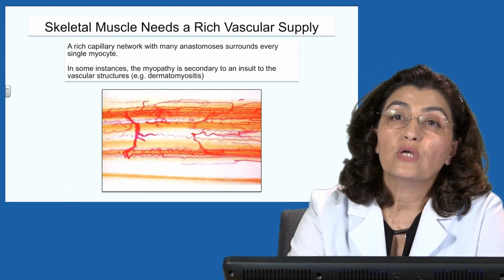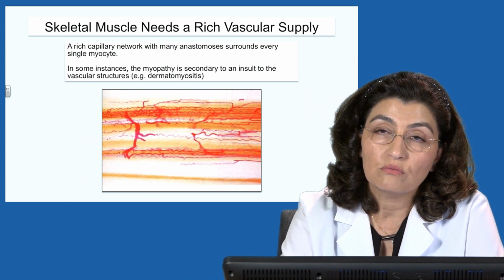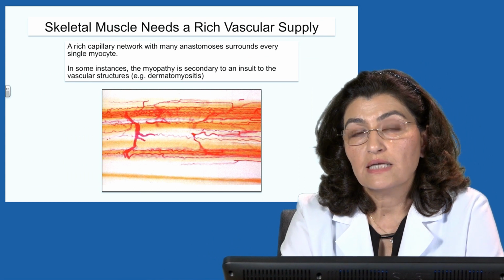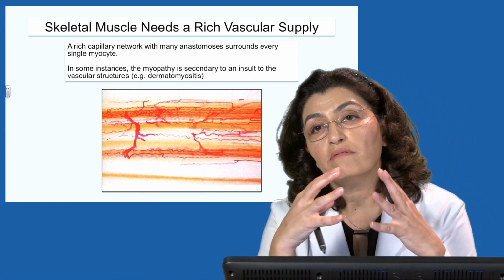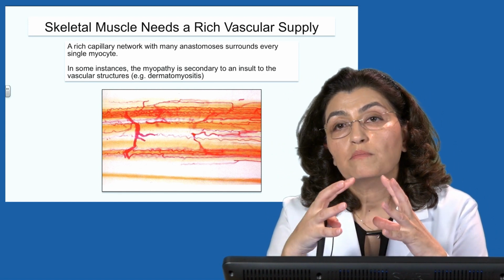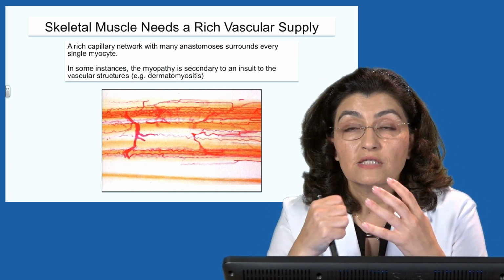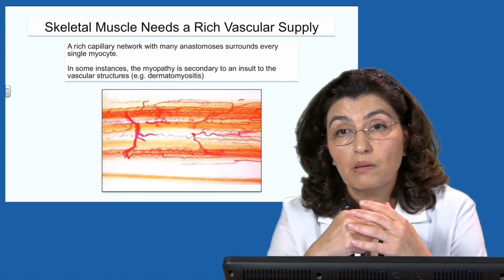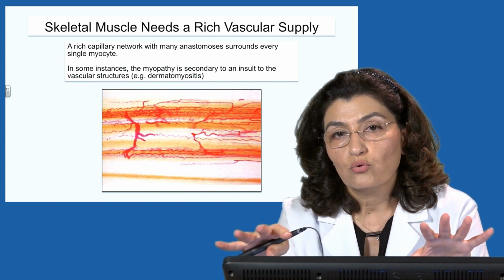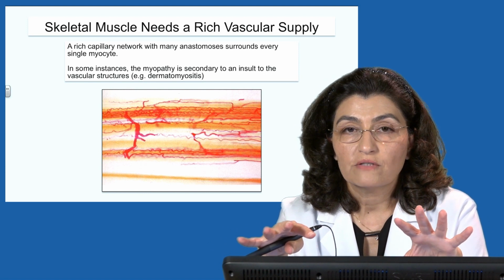One of the ways of looking into the reactivity of the skeletal muscle and also regeneration is using alkaline phosphatase. Alkaline phosphatase is very, very reactive with reactive fibrovascular core. Muscle biopsy, skeletal muscle is very richly vascularized because obviously it's working all the time, it needs supply. And these vessels at normal status quo, they would not be expressing too much alkaline phosphatase.